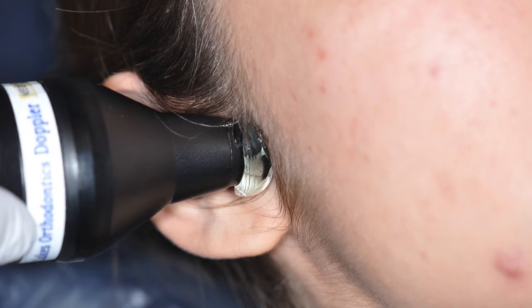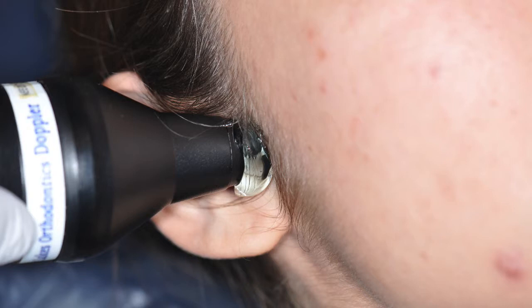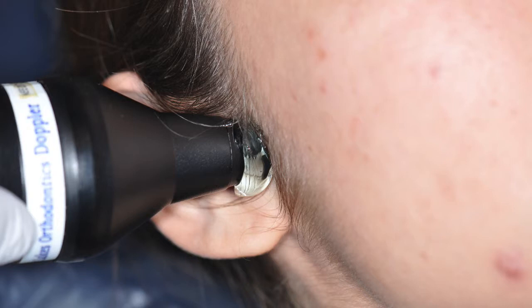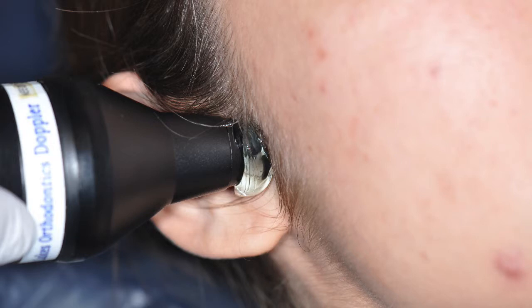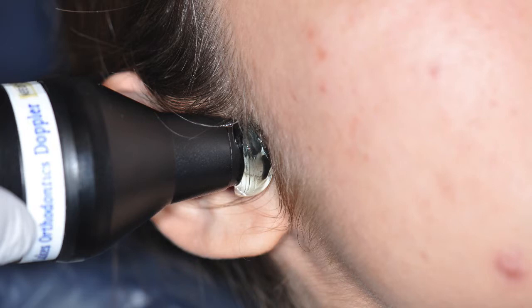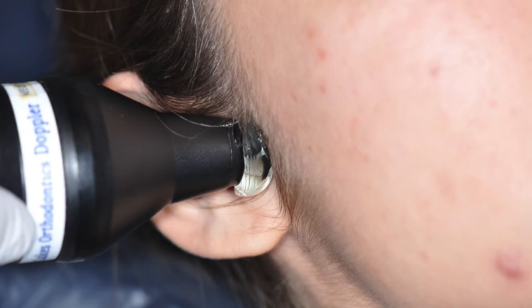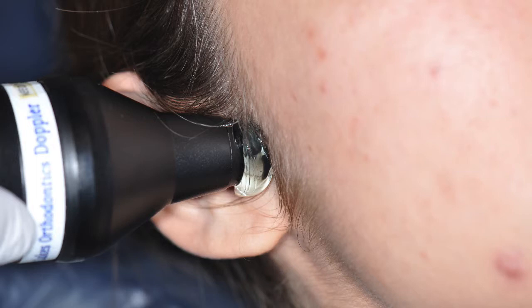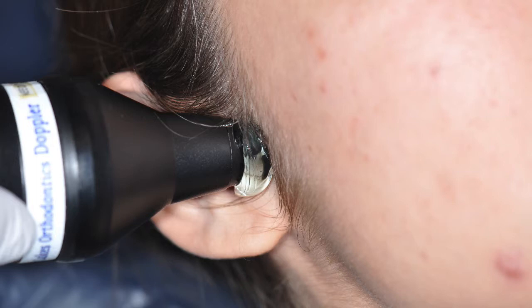If you observe the Doppler video, you'll see there is definitely background noise. The first thing I do is locate the superficial temporal artery, then have Shelly open and close three times fast after redirecting the Doppler away from the arterial flow sounds, so I know I'm at the position to maximally hear joint movement. I then isolate rotation and translation. Rotation is the first quarter inch of opening — you'll hear it's quiet except for background noise. Translation is opening past a quarter inch — you'll hear crepitus or increased noise beyond background. I can also have her move toward me, a working side movement, which is quiet, versus away from me — a balancing or non-working movement into translation — where you'll hear crepitus.